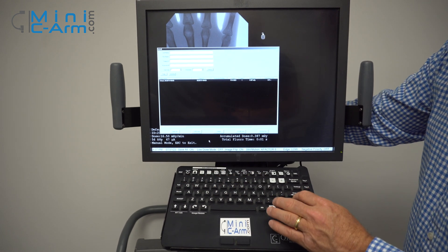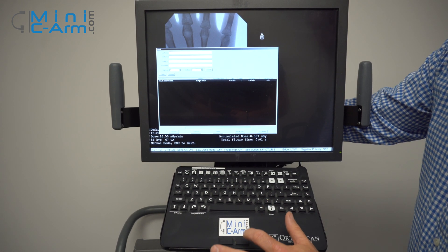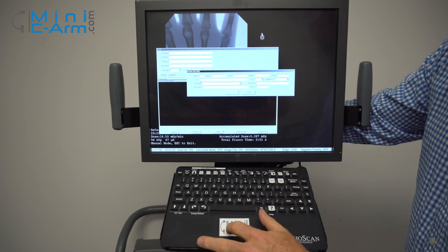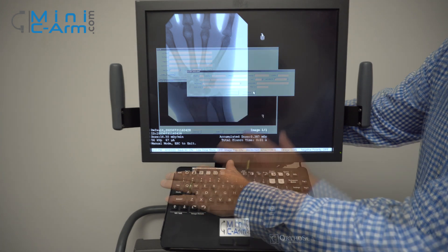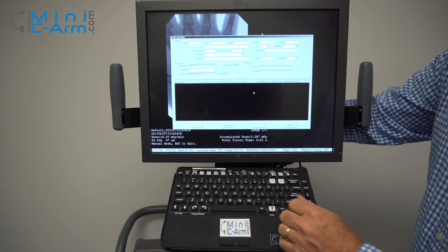Here's also your recall screen where you can choose your case. You can also modify any of your patient information from here at any time, just by hitting the patient info button.